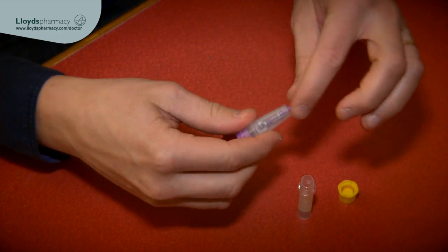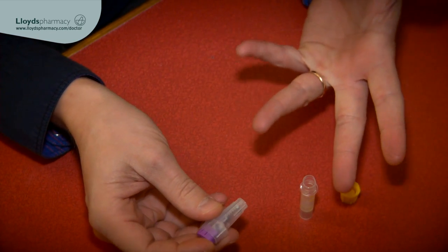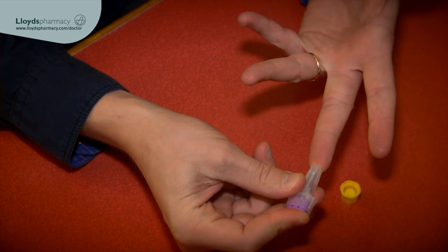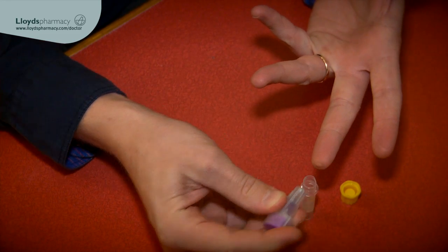I take the lancet and I twist the purple bit off the end. And now here we go — this is the bit I'm not looking forward to. I press the lancet against my finger and I've got to push very hard. Well that didn't hurt at all.